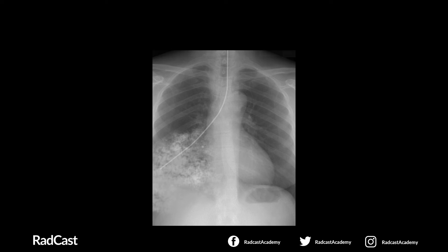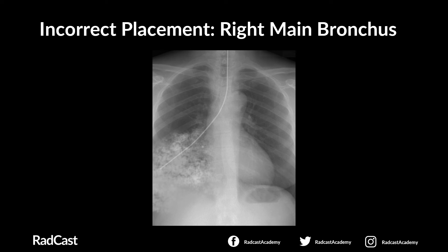With the next chest x-ray, after confirming patient details and viewing field: step one, is the NG tube descending in the midline? Yes. Step two, is it clearly bisecting the carina or bronchi? No — it is passing into the right main bronchus into the right lung. It appears the patient has unfortunately been fed through this incorrectly placed tube, and you can see material in the right lung. This is an incorrectly placed NG tube in the right main bronchus.